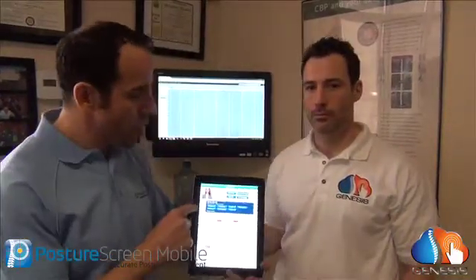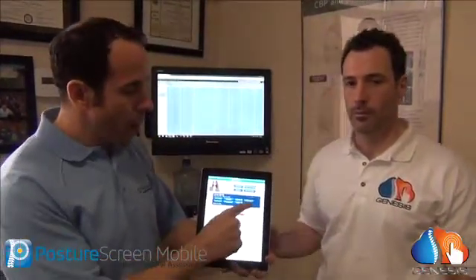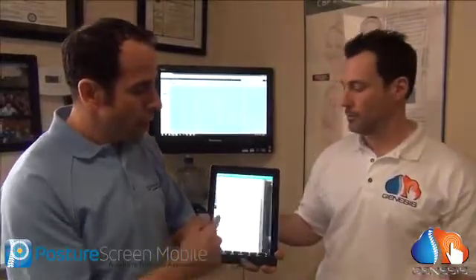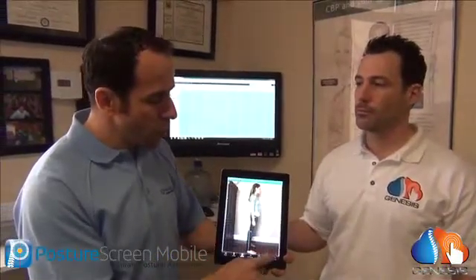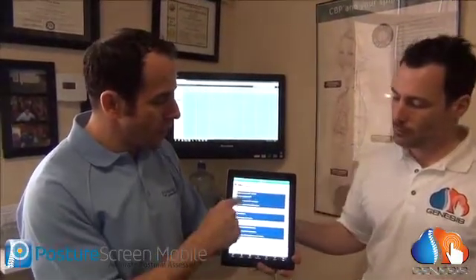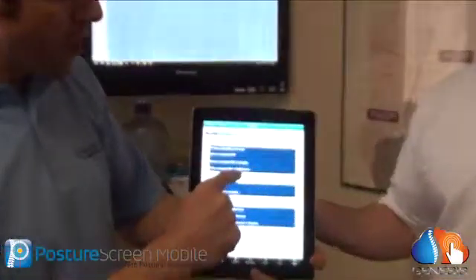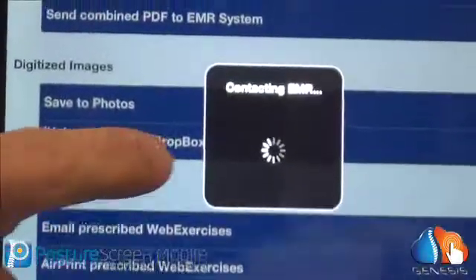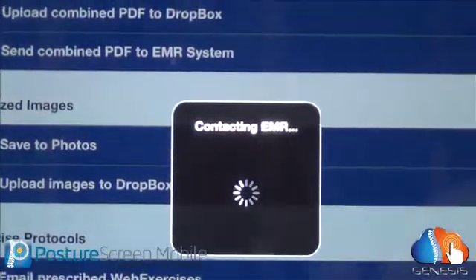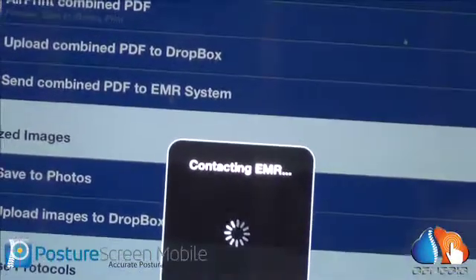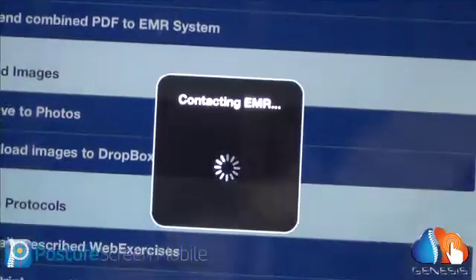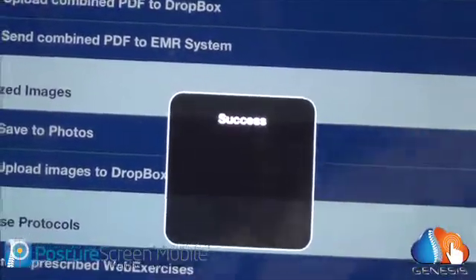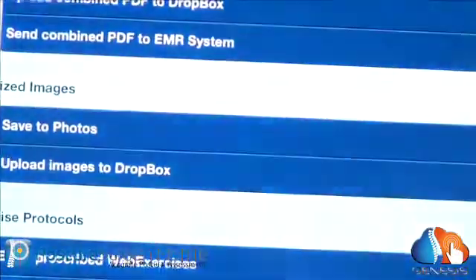So what we're going to do is a quick demo in real time with Cheryl. If I was ready to send, instead of sending an email, I'm going to say 'send combined PDF to EMR system.' And as you can see, it's contacting the EMR and sending in real time to the Genesis Chiropractic Software, which is cloud-based so you can access it anywhere. And it's a success.